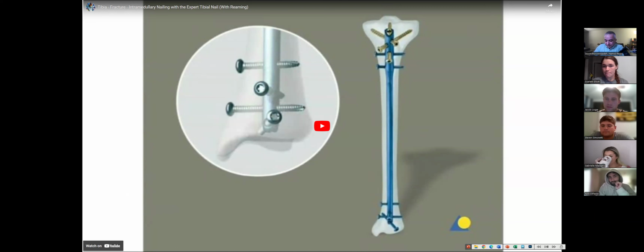Usually there are many factors. Classically, the type of the fracture and the demand of the patients are the most important factors. Based on these two, you select a nail, biomechanically perfect. But in practice, you must have that nail in your hospital. The patient must be able to pay for it.